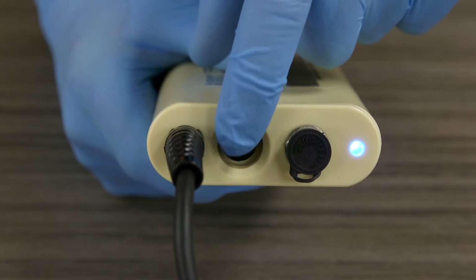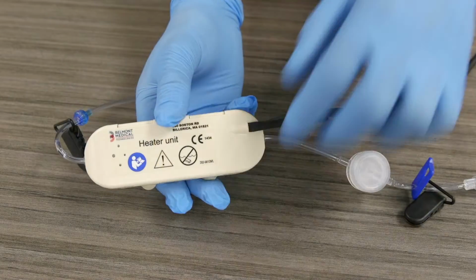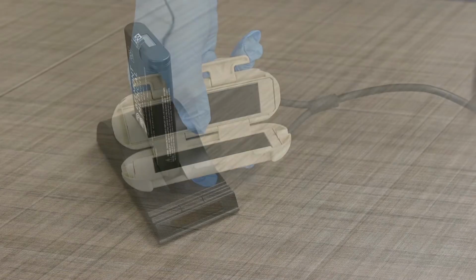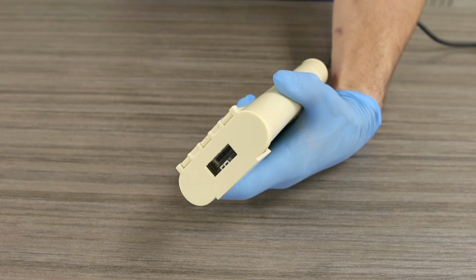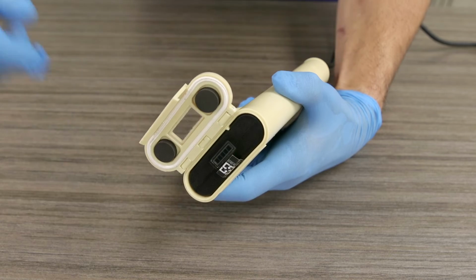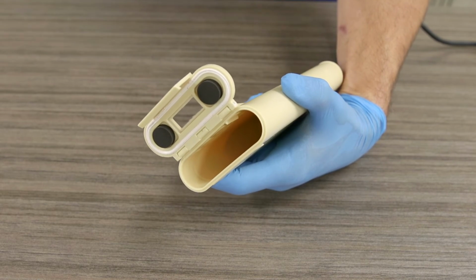Turn off the heater by pressing the on-off button on the battery housing. Unlatch the heater unit door to remove and discard the disposable. It is recommended to recharge the battery after every use. Remove the battery by pushing up on the latch of the battery housing door. Pull up on the tab connected to the battery to remove the battery from the housing.